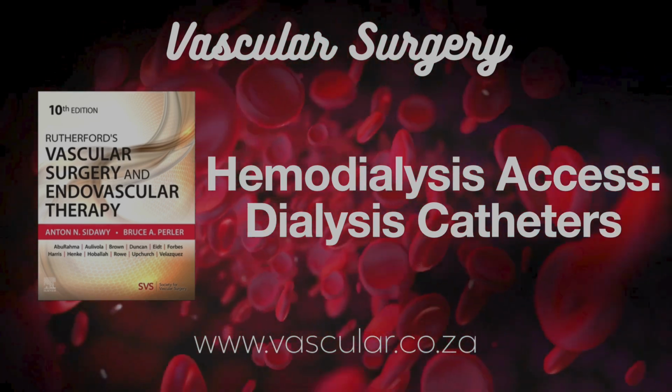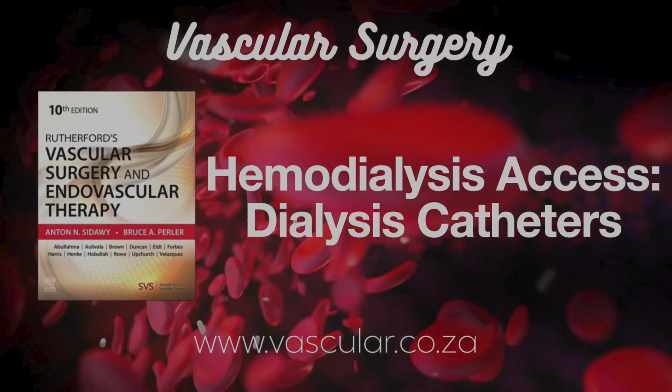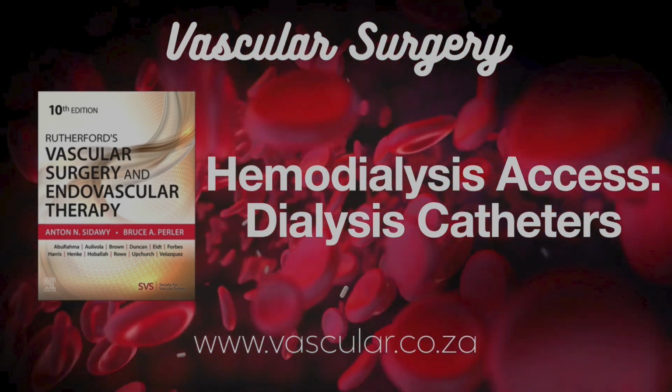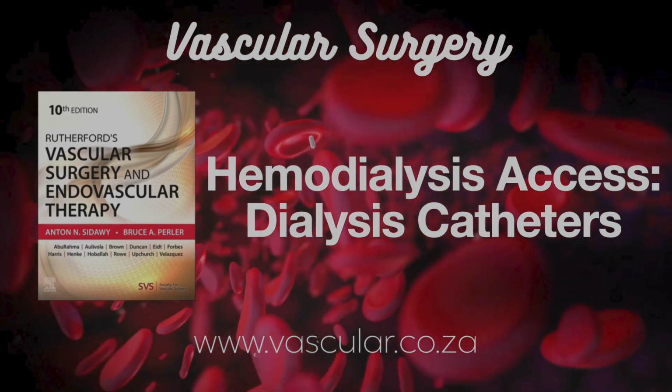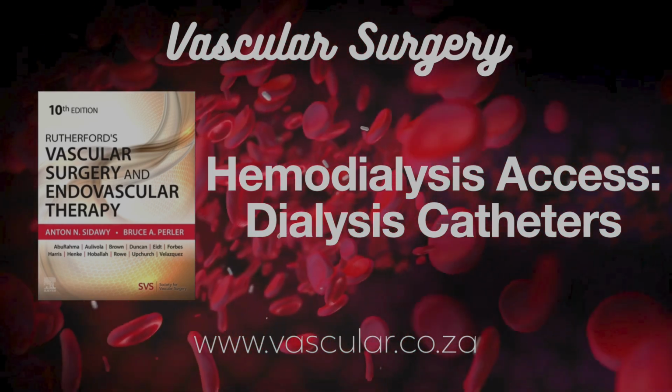What if it's in the wrong vein, like the subclavian or hepatic vein? Can injure the vein lining, cause clots. A stiff catheter pressing on the wall could even erode through, causing bleeding. Fluoro helps get the length right and spot kinks.